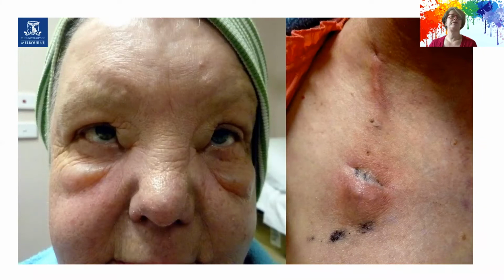The impact of the infection and thrombosis was an immediate 2 days in hospital with surgery to remove the infected device, a second hospital visit for the surgical procedure to reinsert another device, and with the associated clinical risks and insertion costs. 6 months of a daily subcutaneous anticoagulant, and pain, discomfort, and bruising from the daily injections, worry and additional time for the patient.